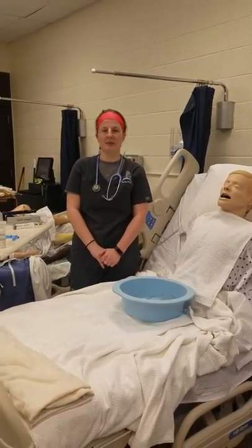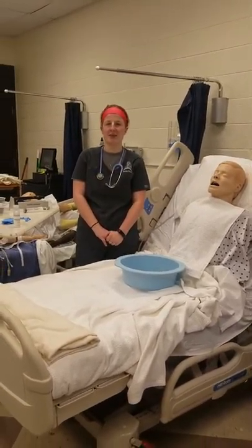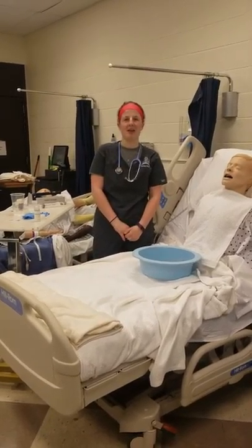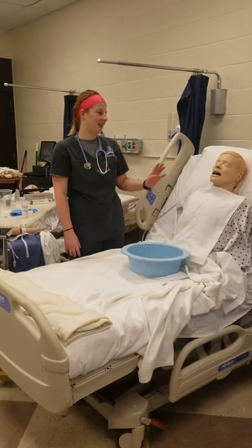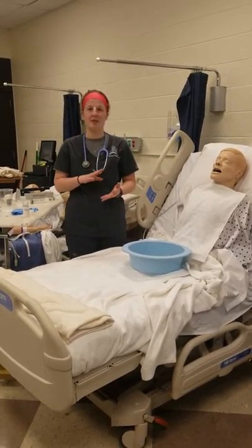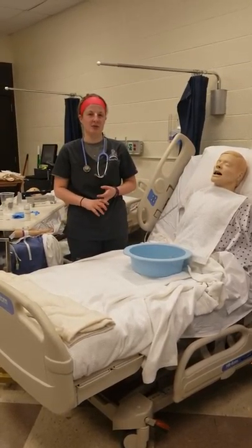Hi, my name is McGinsey Barrows. I'm a 7th semester nursing student and today is February 15th, around 11:30 in the morning. I'm going to be demonstrating NG tube insertion, NG tube medication administration, and removal of the NG tube.